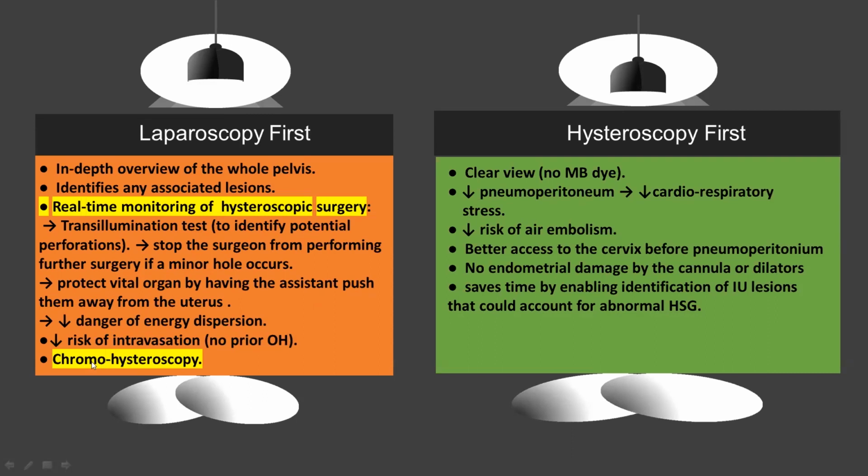In addition to the decreased risk of intravasation. And lastly, and importantly, which is the point of this talk, is the possibility of doing hysteroscopy after injection of methylene blue into the endometrial cavity, which is called chromohysteroscopy.